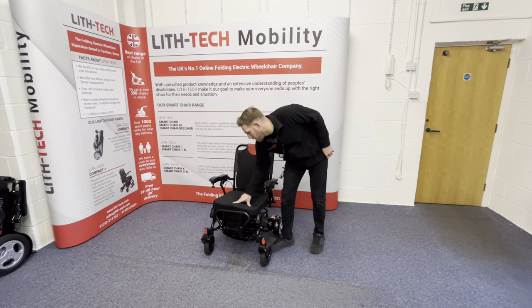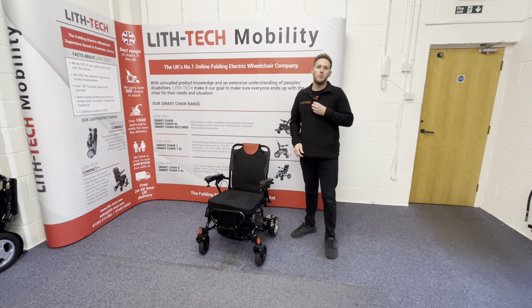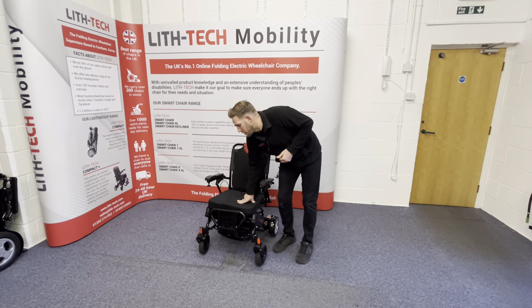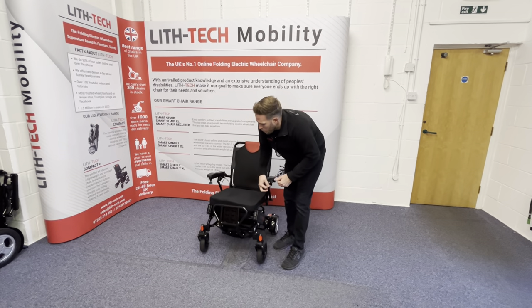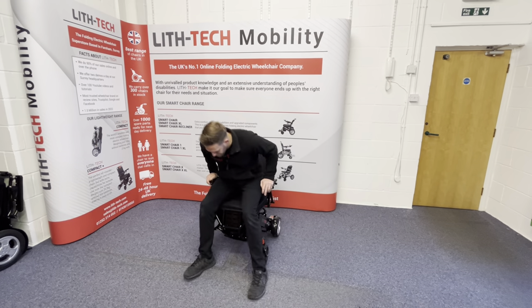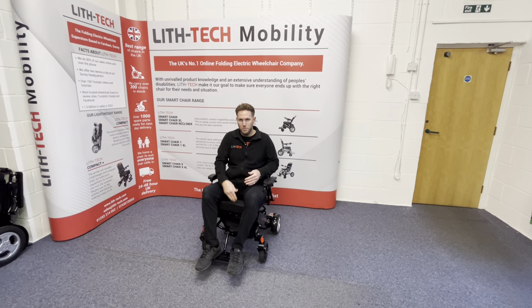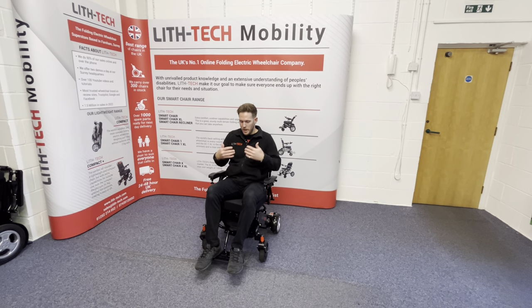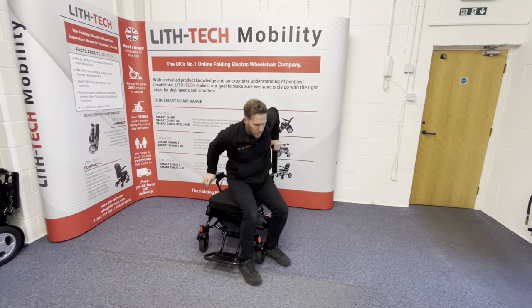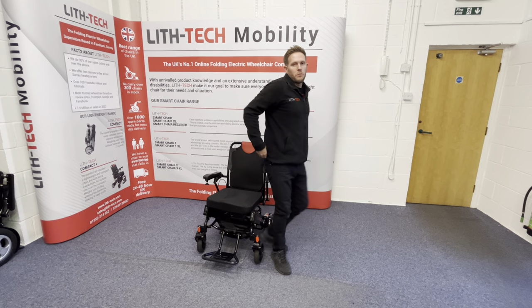This chair comes with an upgraded contoured cushion as standard. We sell these separately as our upgraded cushion — it's probably one of our two best-selling products along with our upgraded front wheels. It sits a little bit higher, which means getting in and out is nice and easy because you've got space between the footplate and the top of the cushion with nothing to catch. It gives you lots of options for entry and exit from the sides as well.